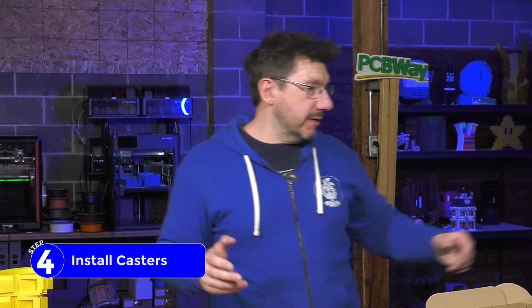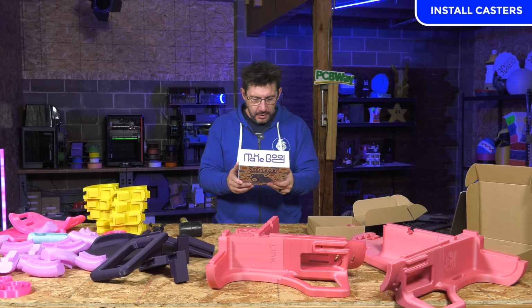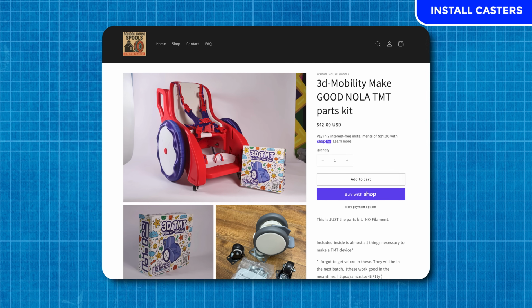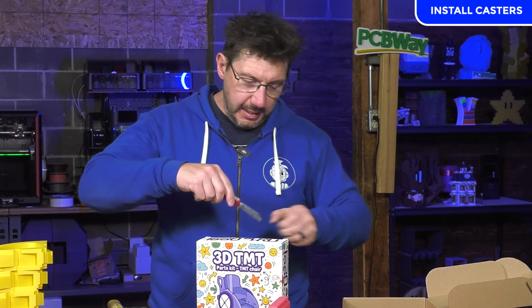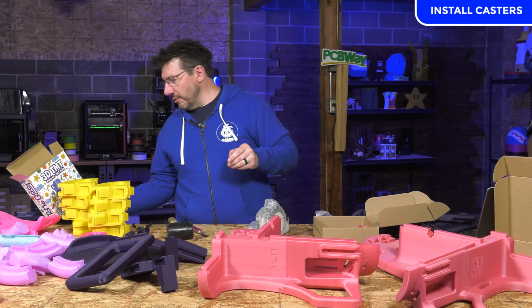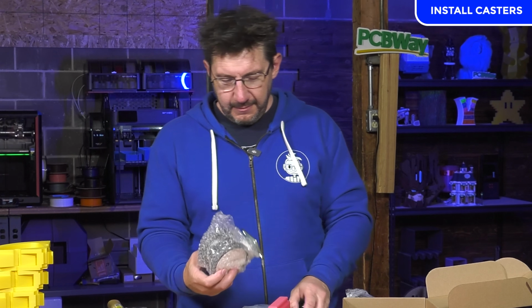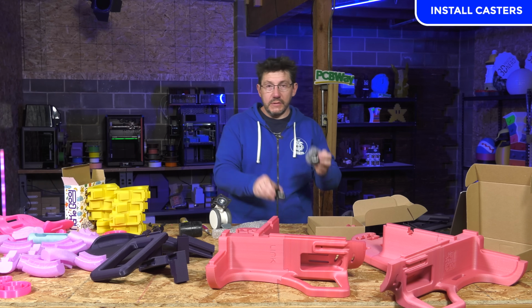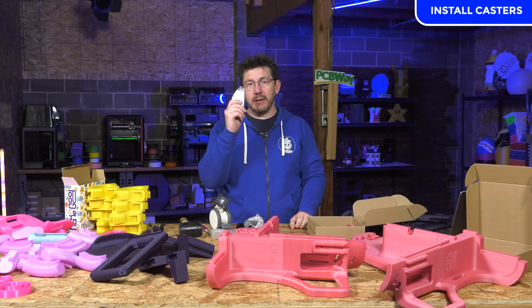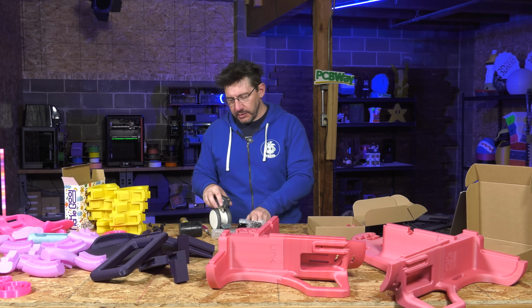There we go. Next up is the main caster. And for that, I get to show you something cool. So MakeGood has partnered with Schoolhouse Spools, looks like, and they've got themselves a kit. Everything you need that's not 3D printed in order to put a TMT together. Then you don't have to source this caster yourself. The two smaller casters and some bolts, nuts, screws, bearings, that's all included. You don't have to source it yourself.